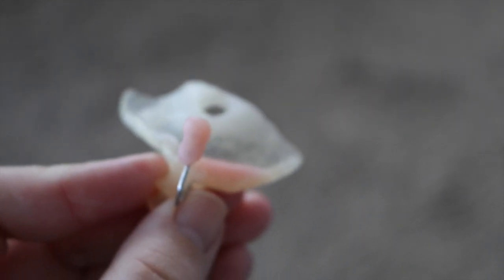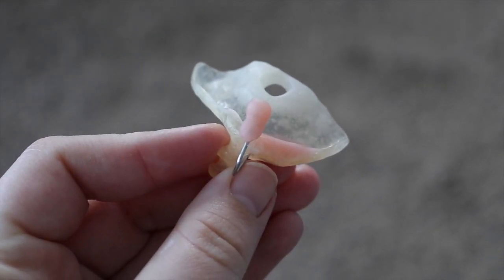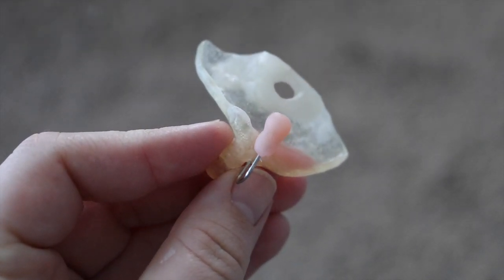There's also a little hole on the top of the NAM, and this is in case it falls down in his mouth and comes loose — he'll still be able to breathe.